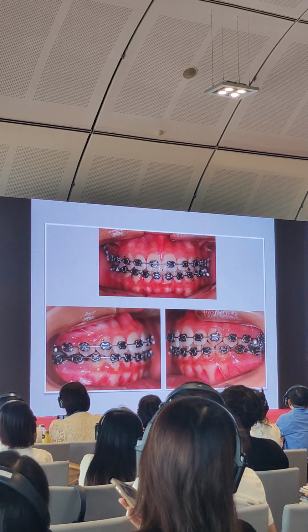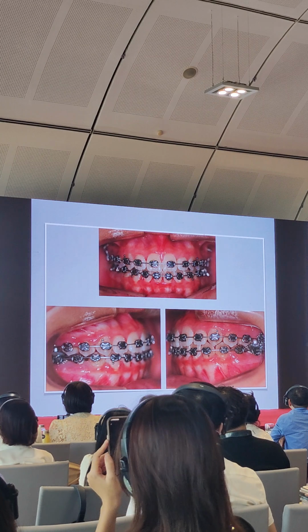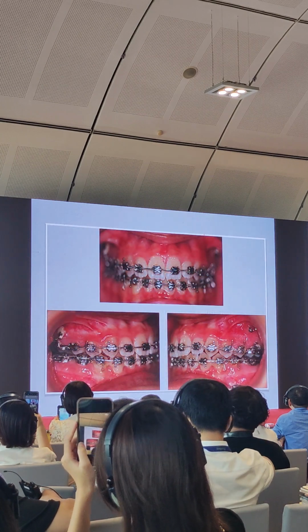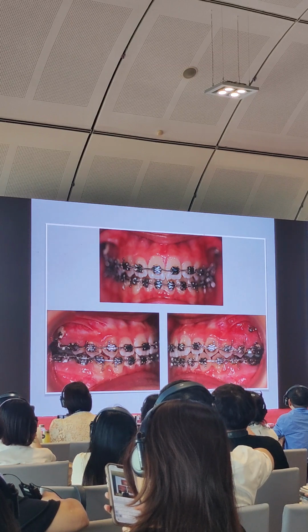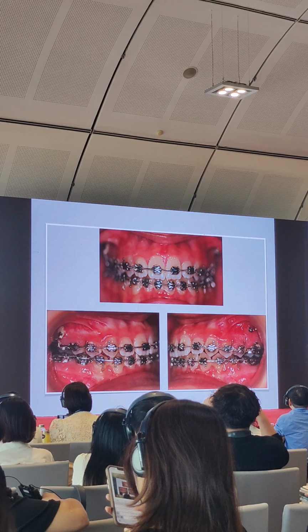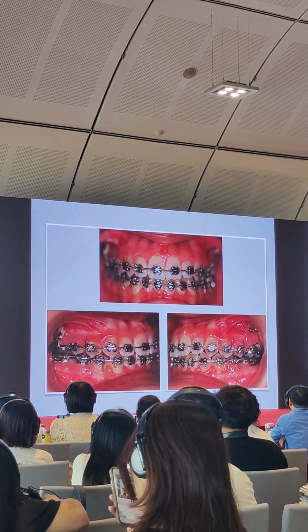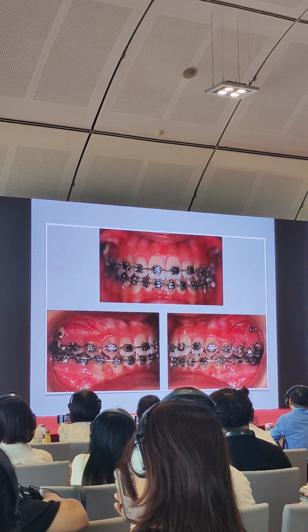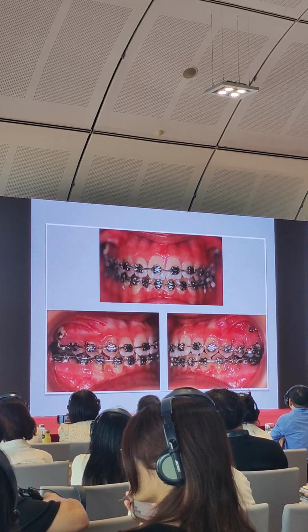The patient is not wearing any elastics anymore, although she never wore them beforehand. So I tried to interdigitate on the premolar area. I placed Kobayashi, and I asked the patient to wear box. Of course, the patient will not wear the elastic, because during the time when I asked her to wear elastic during the MEAW mechanics, she did not wear it. What more now will she wear? So she did not wear the elastic.